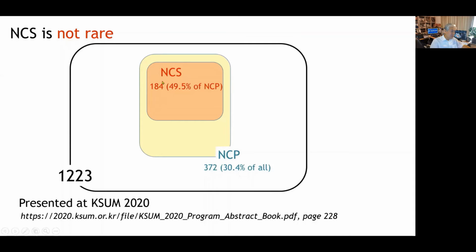And 184 of these 372 patients, approximately 50% of those with nutcracker phenomenon, could be diagnosed as nutcracker syndrome.